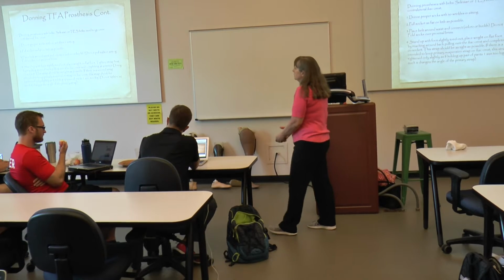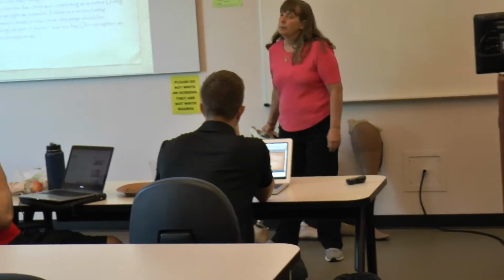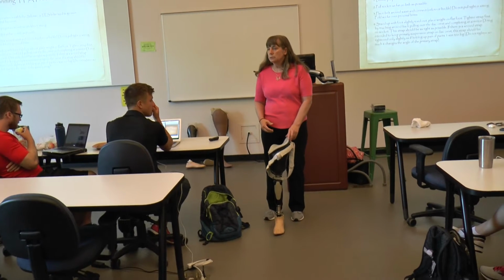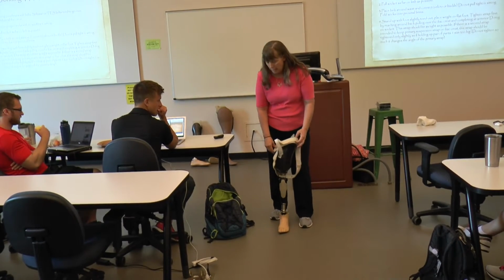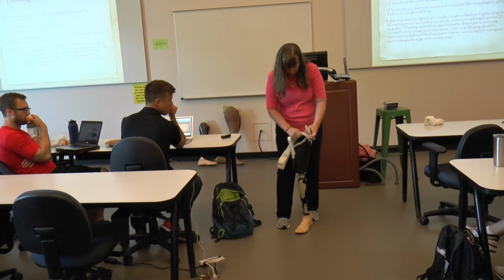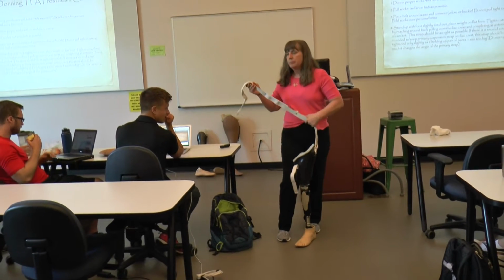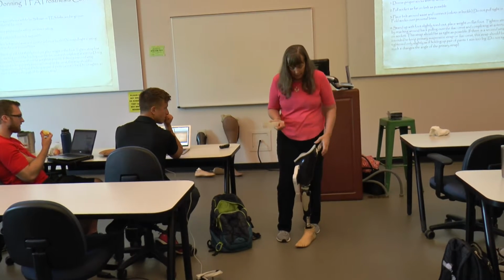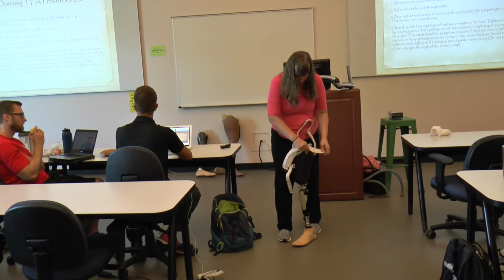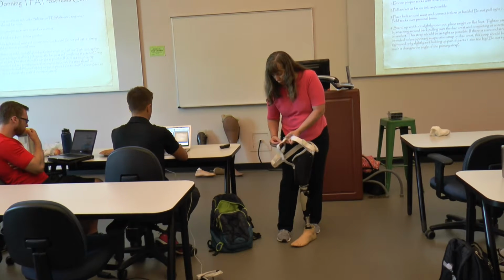If someone has a Silesian belt, let's say I'm wearing this with a sock interface, I would put the socks against my skin, pull them up with no wrinkles. When I'm sitting, I would probably go ahead and lap it over. This is a left leg. I would put the Silesian belt around the waist. This one's a little bit weird, but I would actually put this belt around my waist while I'm sitting. I go ahead and hook it, but I don't pull it really tight because I will misalign the prosthesis. So I get everything hooked where it's going to go, but loose.